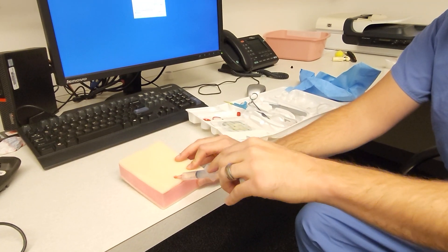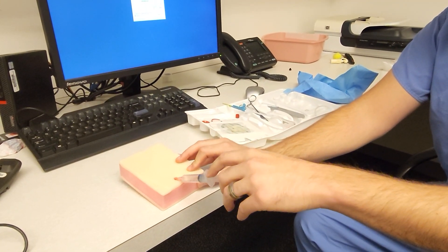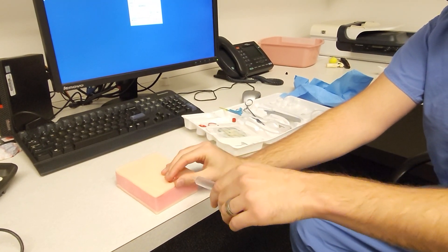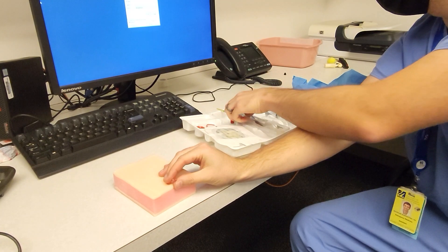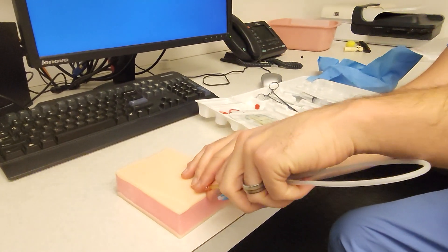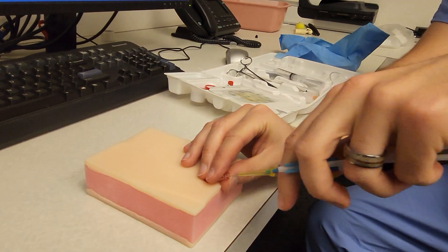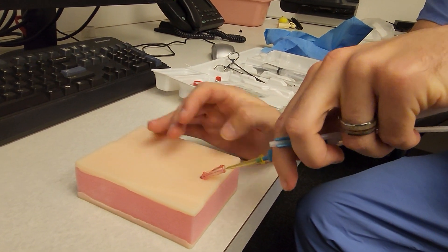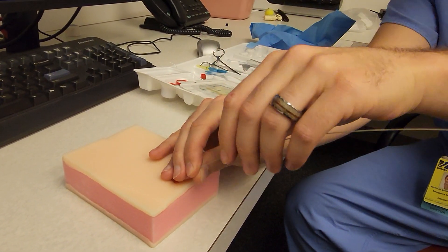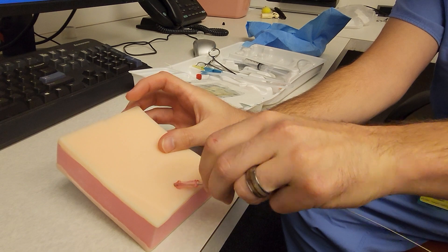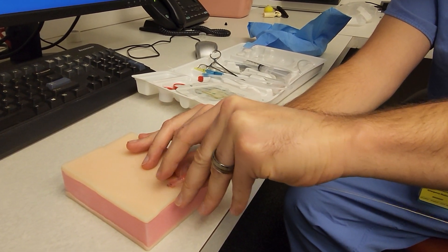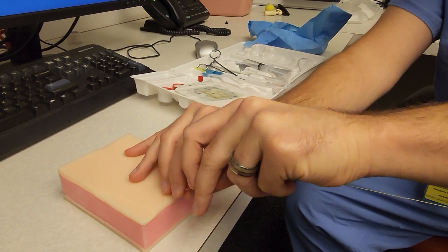Once you have brighter red blood because it's arterial and higher pressure, you stabilize the needle. Take your guide wire, insert, and then you can remove your needle.